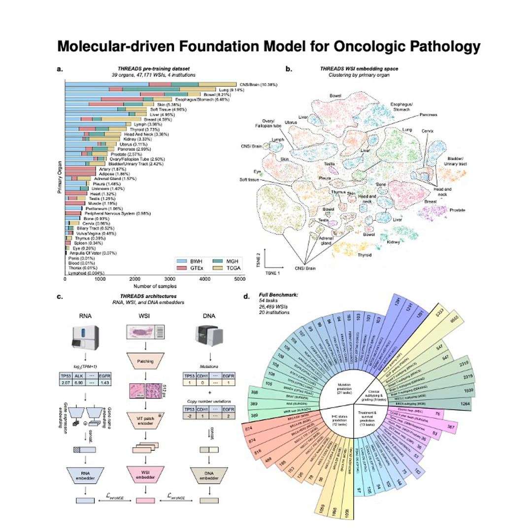Okay, so quick recap of this part. Threads generates these universal WSI representations, these embeddings. But crucially, the learning process isn't guided by subjective reports, but by the objective, deep biological truth found in the NGS data across a really big and diverse data set. That's the core idea, yes.